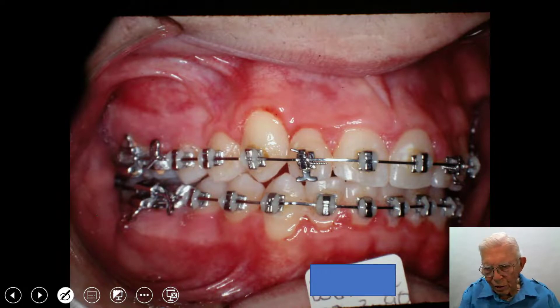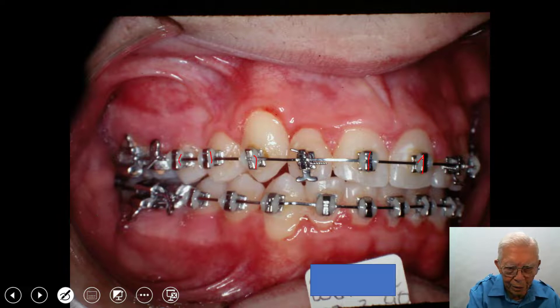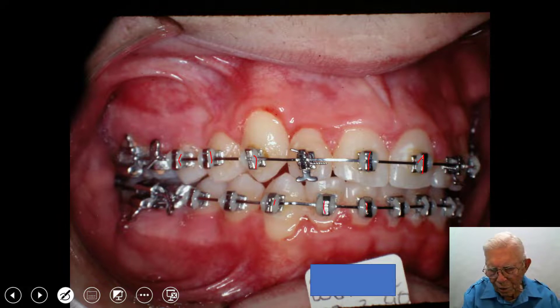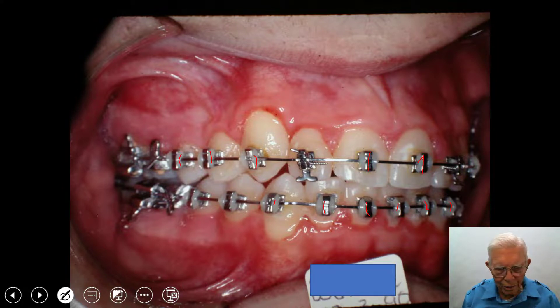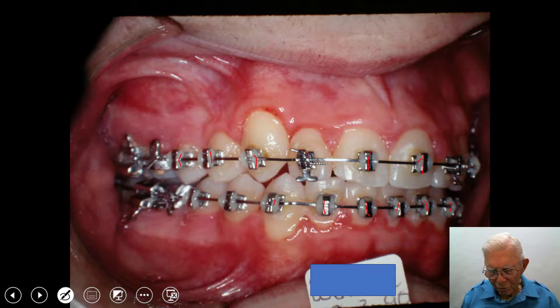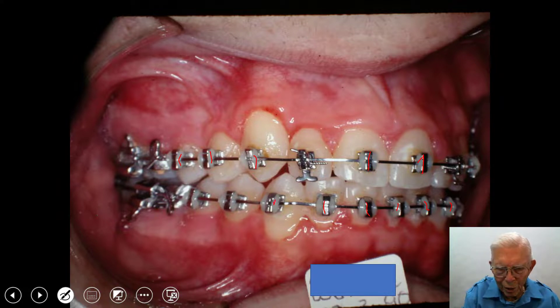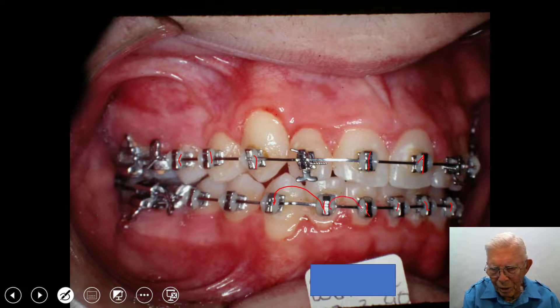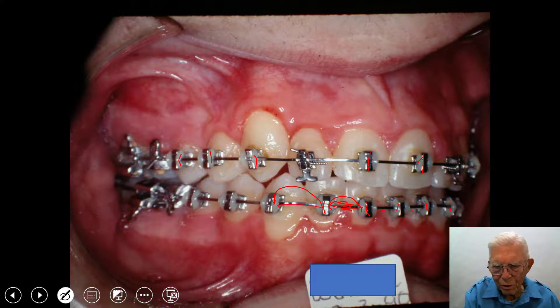Now we're using these small brackets here — just a single gap, some with wings back here, the same thing. These are the little brackets that we use most of the time, and you can do anything you want with the bracket. They're trying to sell some great brackets, but you can take just a small bracket with an inner space like that and put more torque and tip in the arch wire where you have a greater inner bracket space.